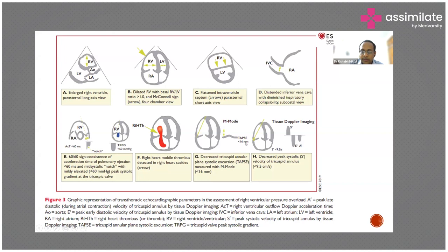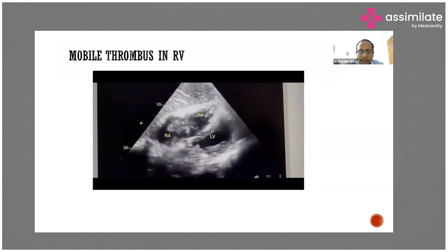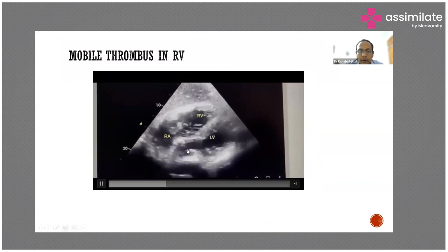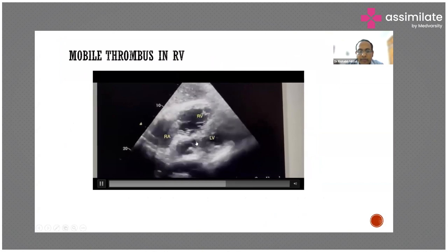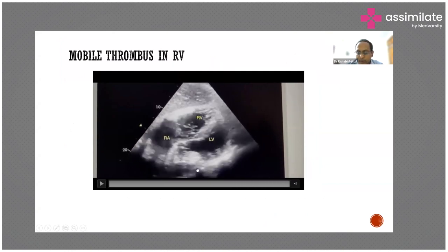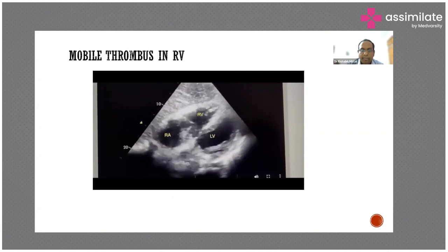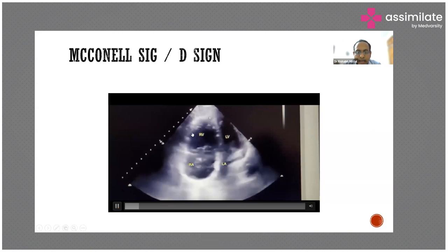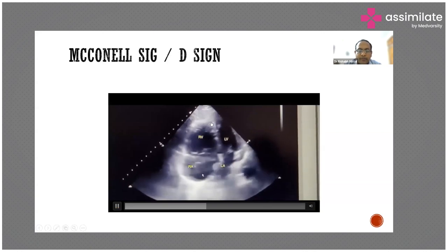This echocardiogram shows a mobile thrombus in the right ventricle and right atrium, moving from the right ventricle to the right atrium — this is diagnostic of pulmonary embolism. In such a hemodynamically unstable patient, we can straight away thrombolyze without needing a CT pulmonary angiogram. McConnell's sign: the RV free wall is not moving but the RV apex is contracting well — this is specific for pulmonary embolism.